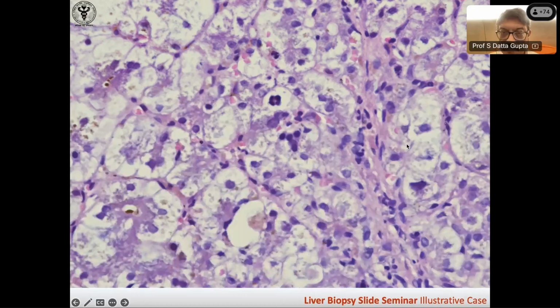That's good. See this? Yeah, this cholestasis here. Right? Here again. I hope that is clear. And look at this, the canaliculi can be made out here with bile inside. So canalicular.